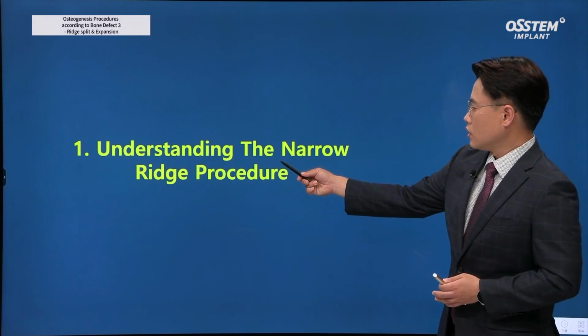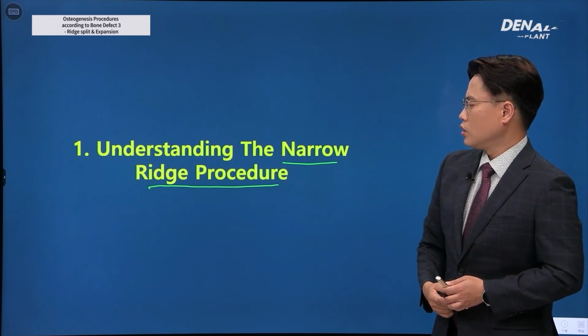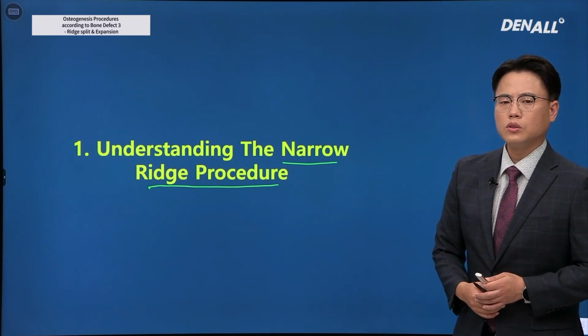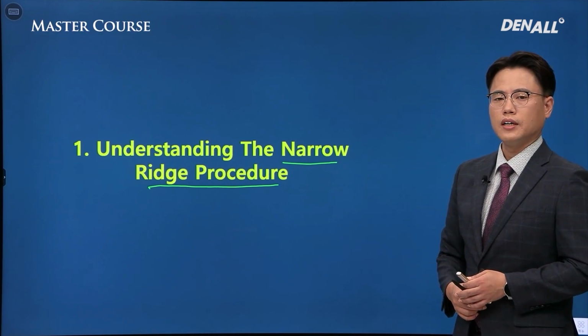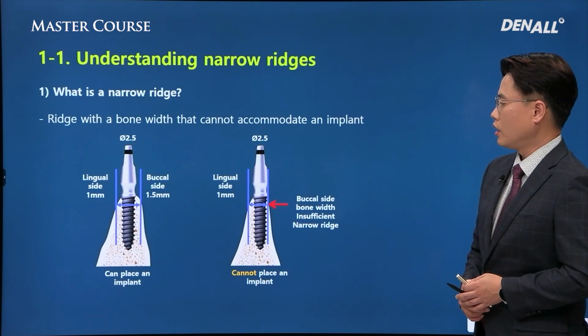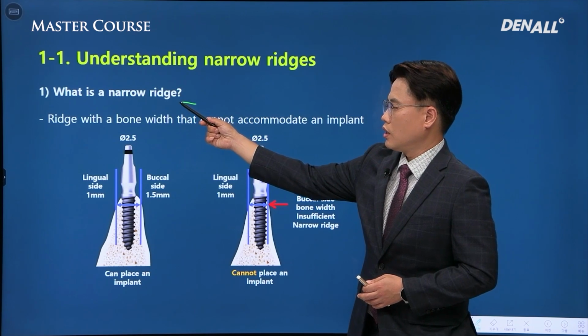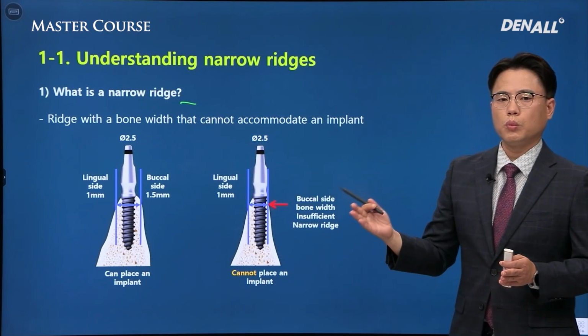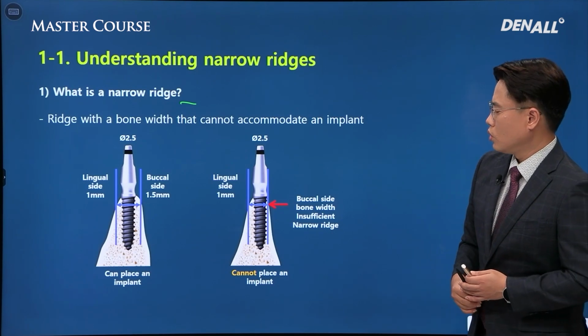First, in the case of narrow ridge, how are we going to proceed with surgery? I'm going to give you a background on this. The definition of narrow ridge. Is the ridge just narrow? The standard is slightly unclear.